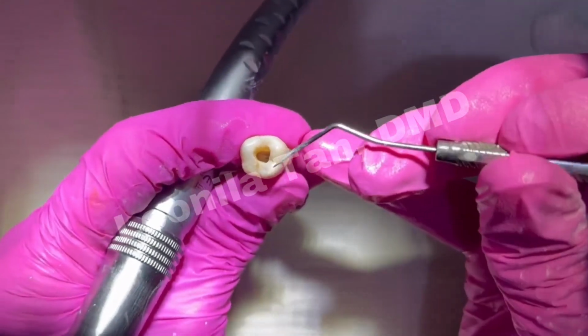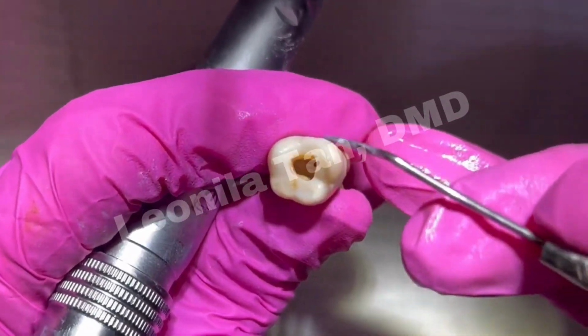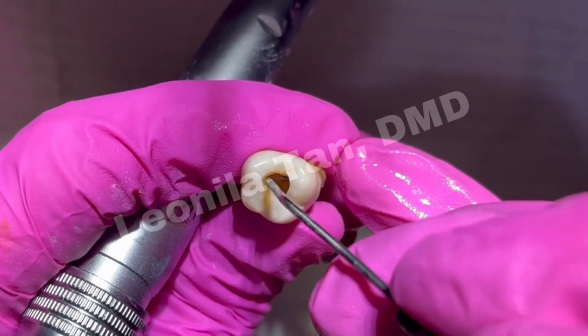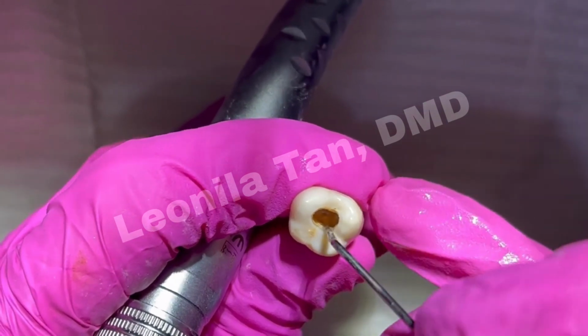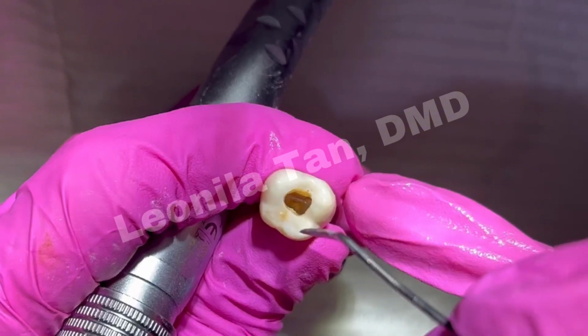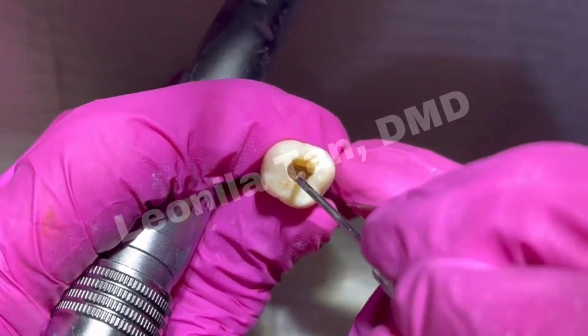So after opening up, flaring or diverging the walls, you'll notice that now you see your orifices clearly. So that's your palatal. Then you have your distobuccal and the mesiobuccal.